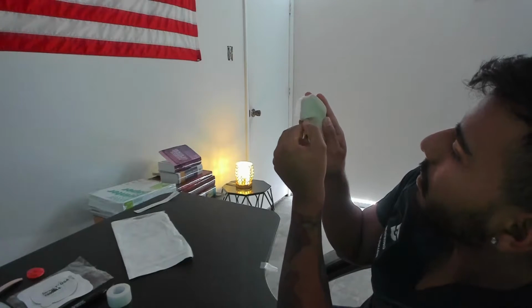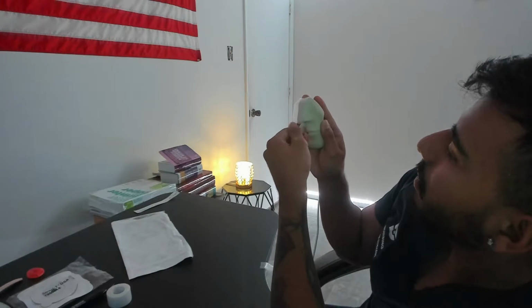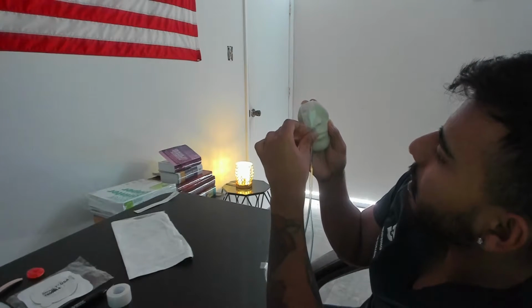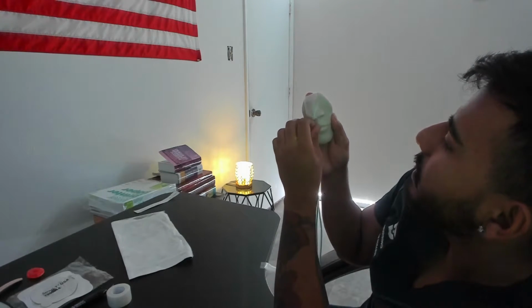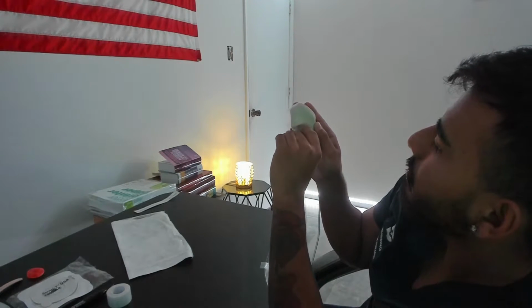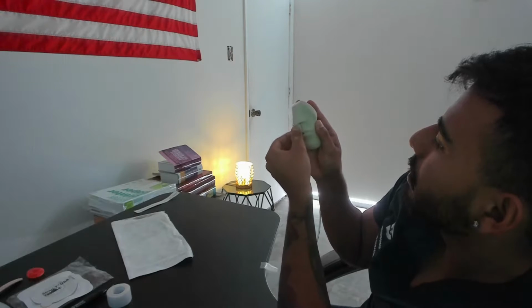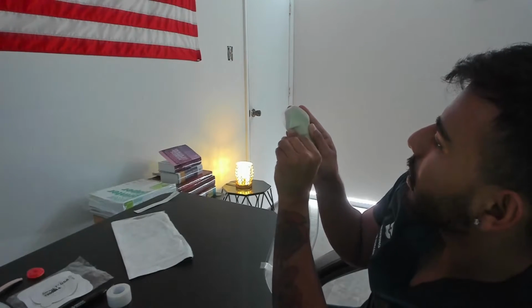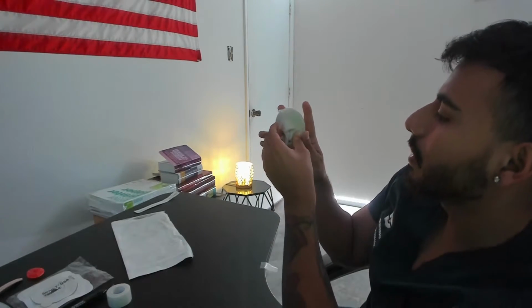They're going to go in the same direction. Go around. And just like that. Now I'm going to get my other piece of tape, and we are going to go the opposite direction. Opposite. And from here, that is how you sling the tape.